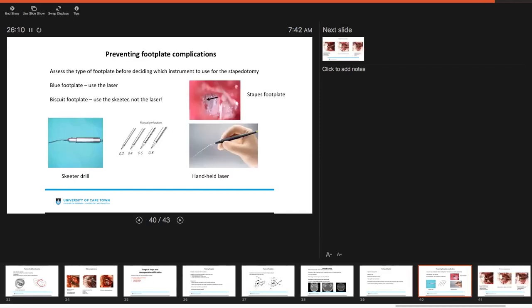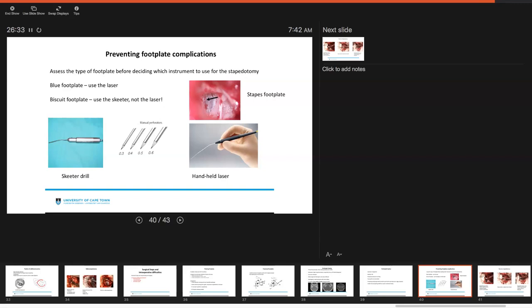How could we prevent stapes footplate complications? You want to assess the type of footplate before you're going to decide what instrument you want to use for the stapedotomy. If you have a blue footplate, you may consider using a laser. However, if you have a biscuit footplate, you really want to be using the skeeter drill rather than the laser. The images just demonstrate the handheld laser and the skeeter drill and as well as the manual perforators in varying sizes.